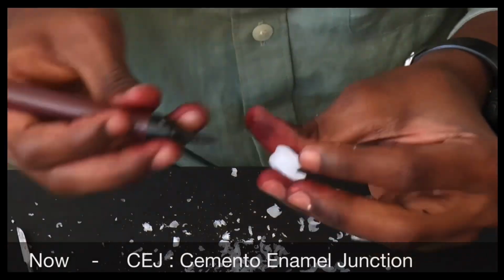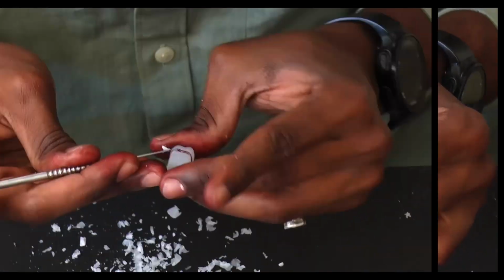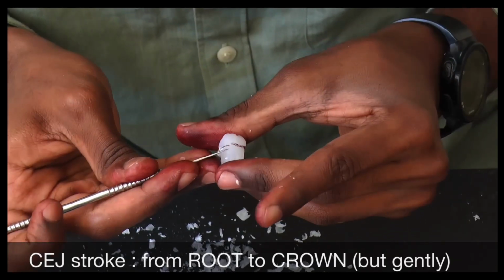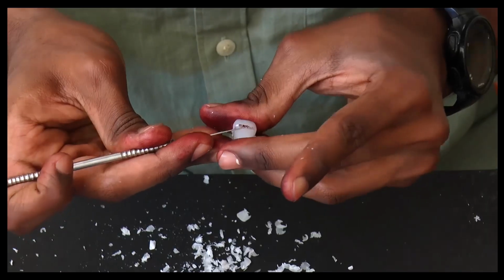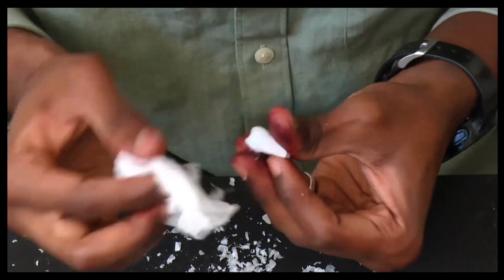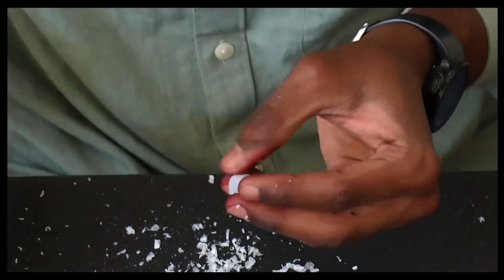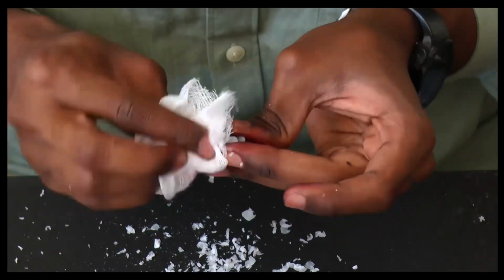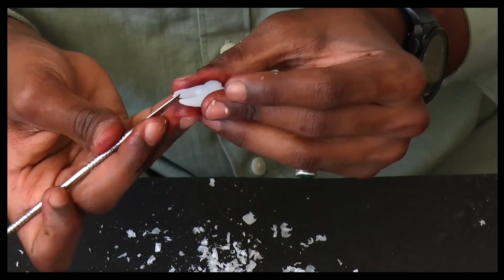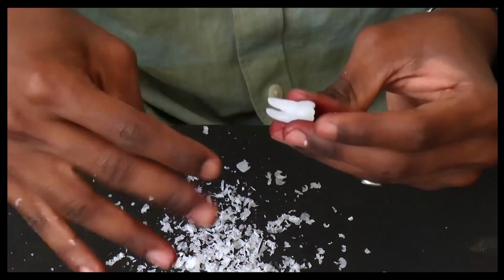So let me draw the CEJ here, from the root to the crown. Okay, so we've carved the entire tooth.